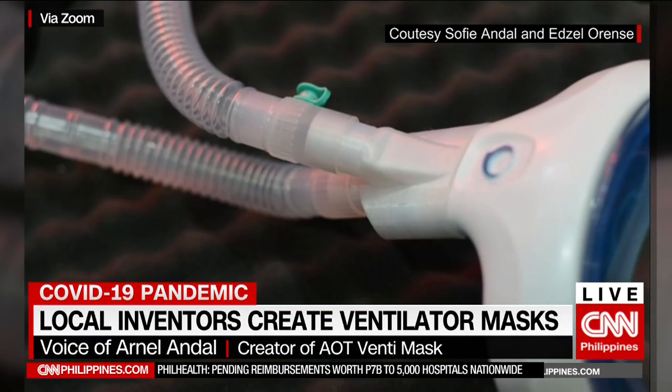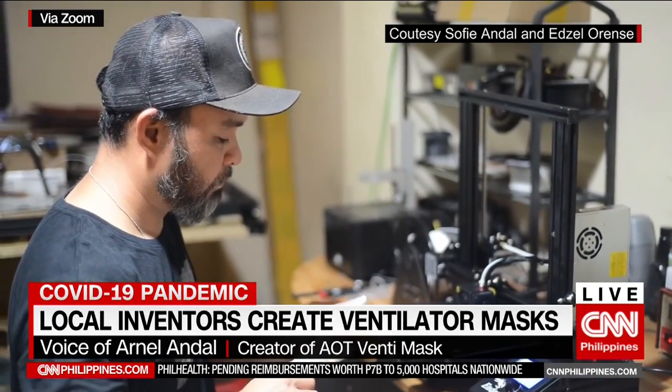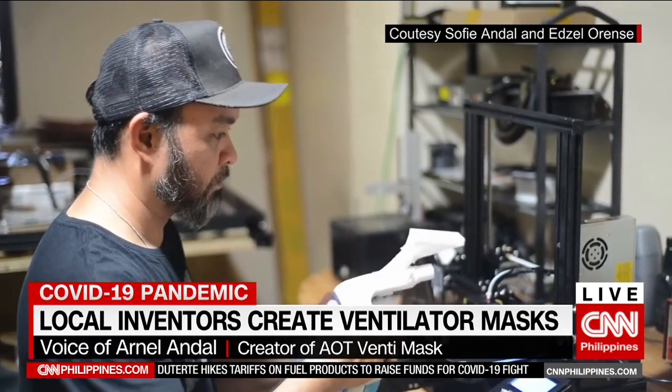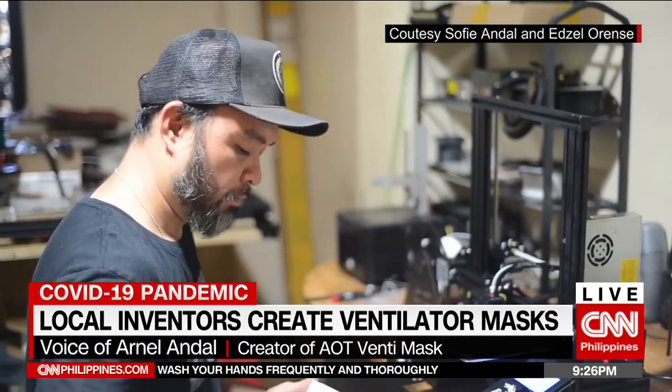This mask has been tested in all ventilators in PJH, and PJH will be releasing their feedback soon. We were informed that it was indeed successful during clinical trials, and it also has to be approved by Philippine regulators.